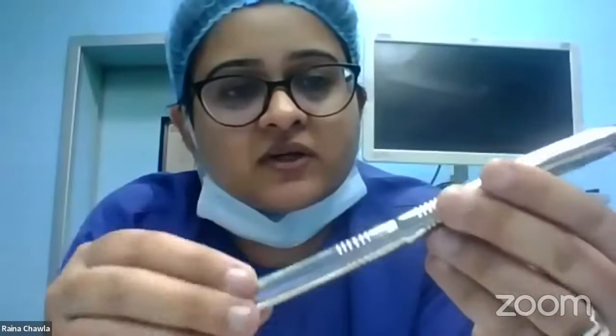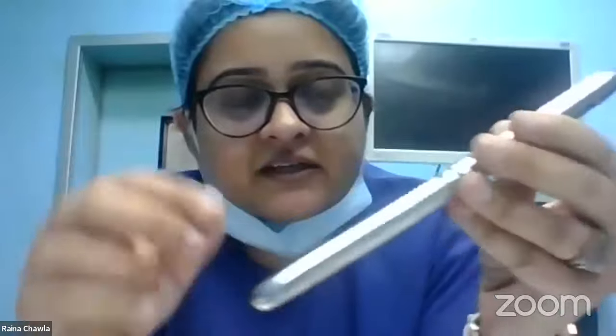This is size 11 and 12. Some dilators are in increasing gradation of 0.5, so you will have 10.5, 11, 11.5, 12. Some are in terms of 1 millimeter. So it's either a 0.5 millimeter or directly a 1 millimeter increase in gradation.